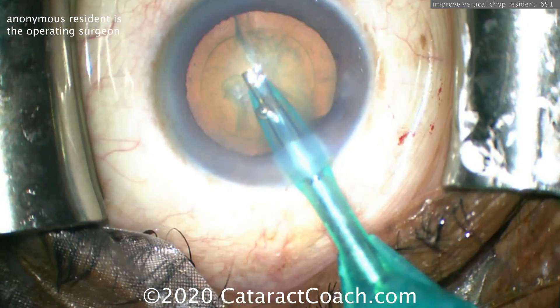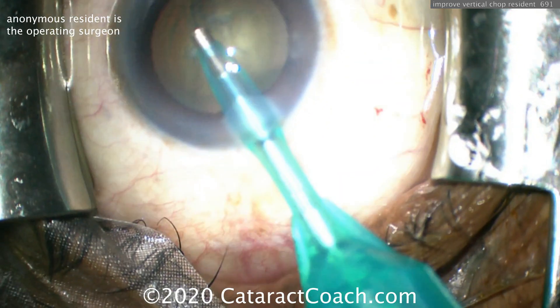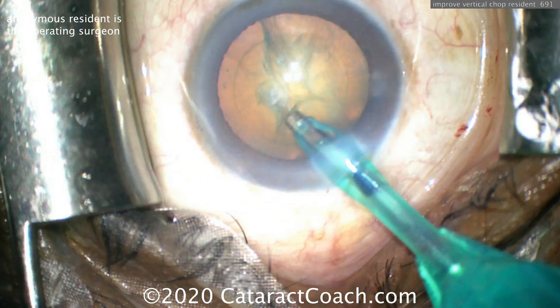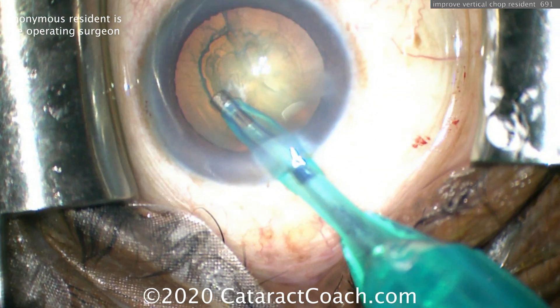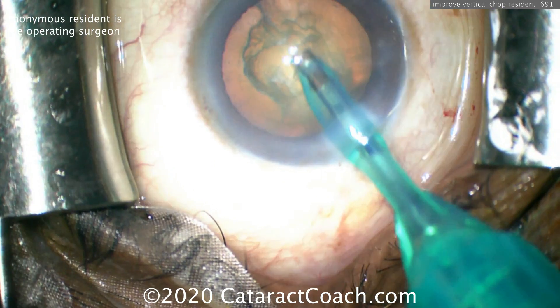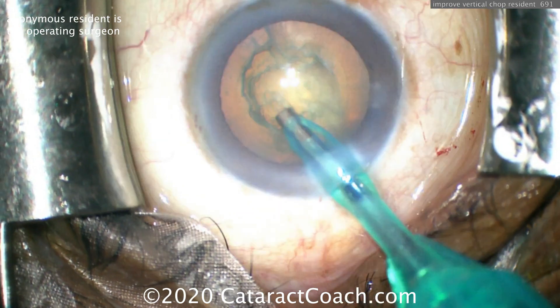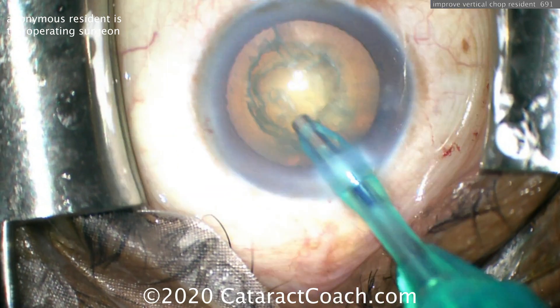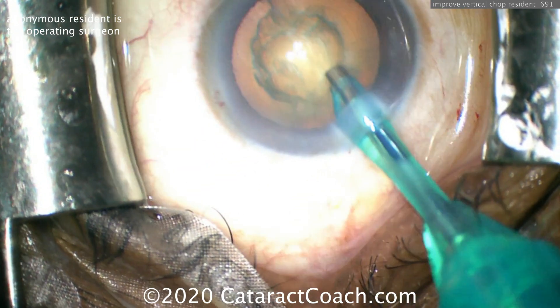Putting the phaco probe in the eye — it's a really nice looking capsulorhexis, nicely centered, nice and round, good size. Cleaning up a little bit of the anterior cortical material to expose that central, denser endonucleus. This surgeon is going to do a vertical chop technique, so let's watch and figure out what we can do to make it a little bit better.